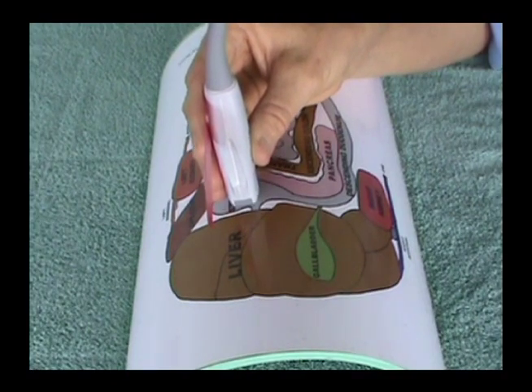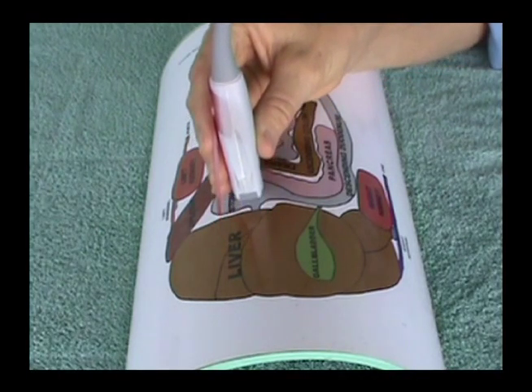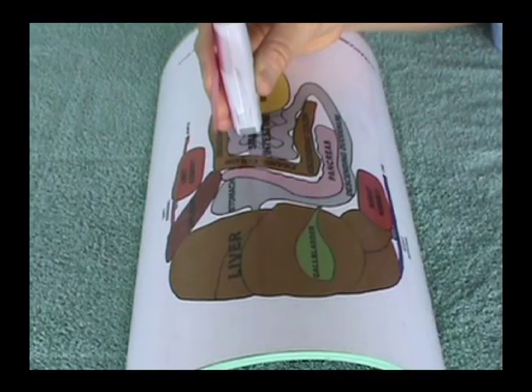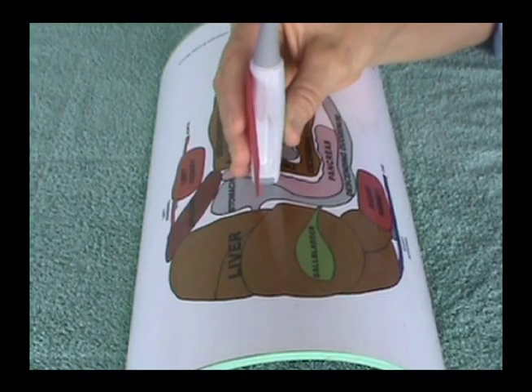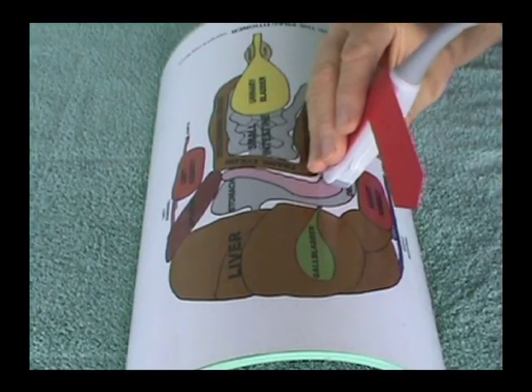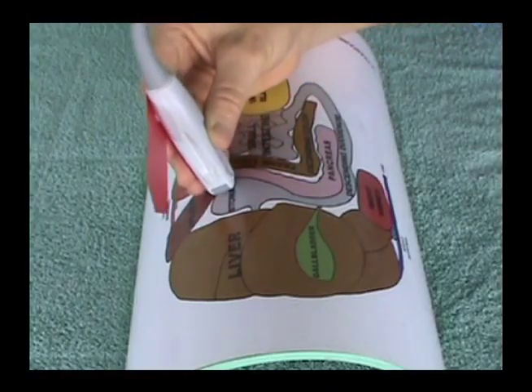Slide from the stomach cranially toward the liver, or slide caudally toward the urinary bladder. Return to the stomach and slide toward the patient's right side, or reverse direction and slide toward the patient's left side.